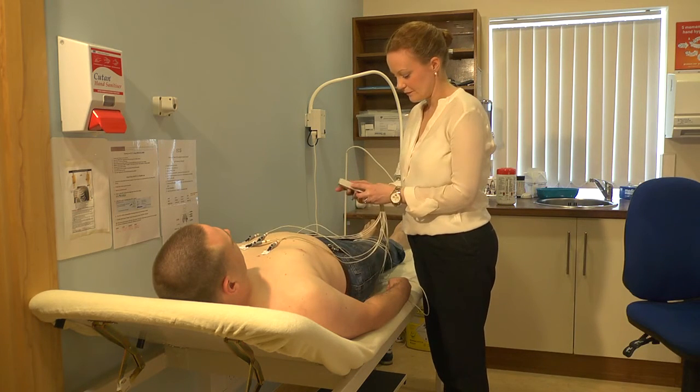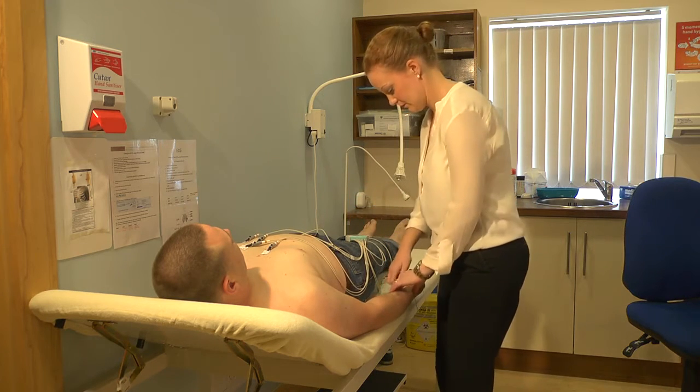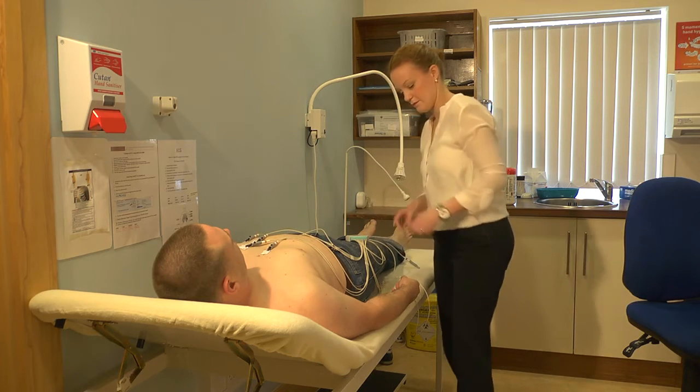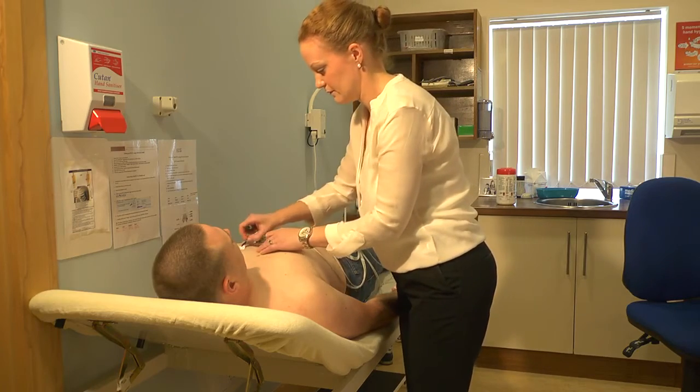All the nurse has to do now is go back to the patient to turn the ECG machine off and disconnect the electrodes. She will normally send the patient in to see the doctor once she has recorded the ECG.